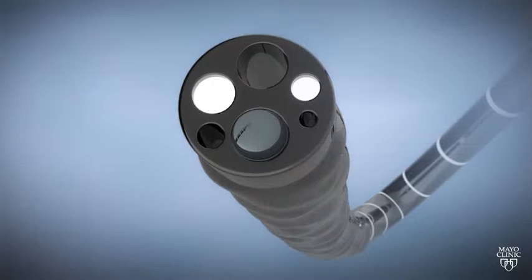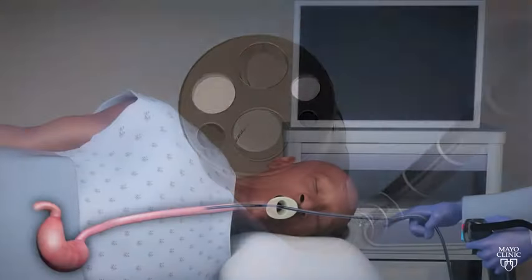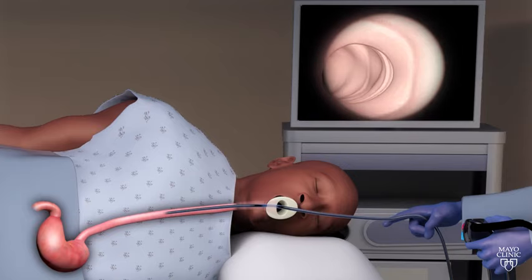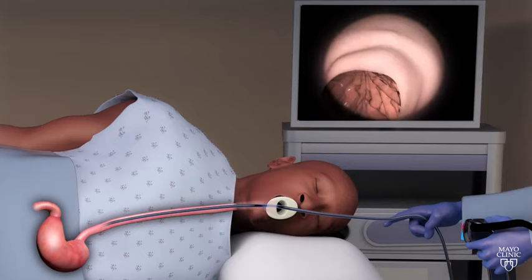A fiber-optic endoscope has a light and tiny camera at the end. Your doctor can use this device to view your esophagus, stomach, and the beginning of your small intestine.